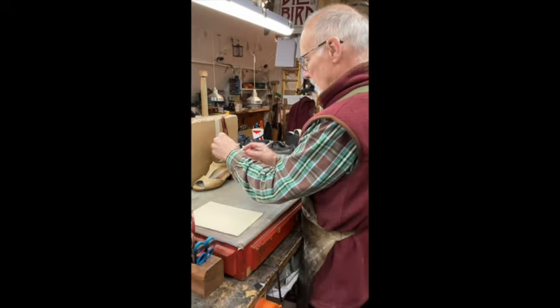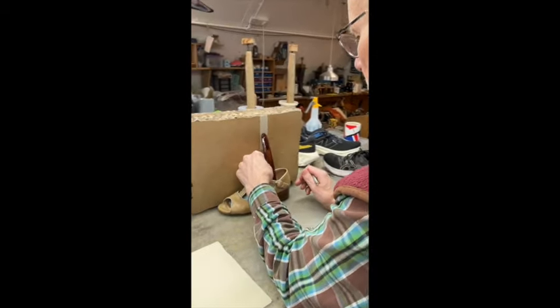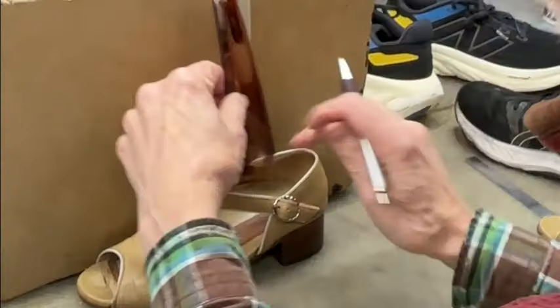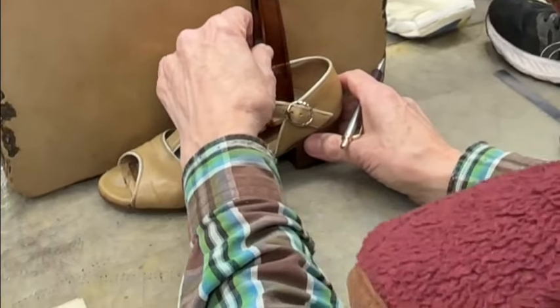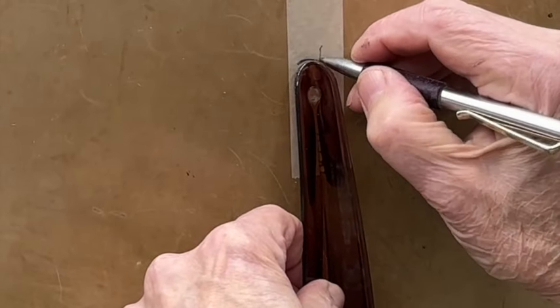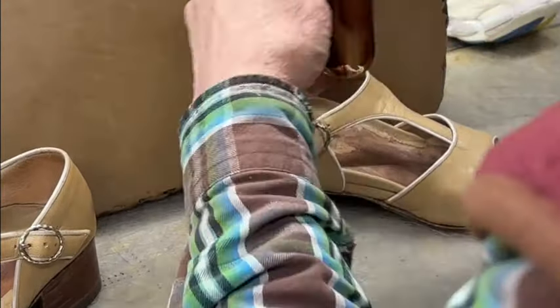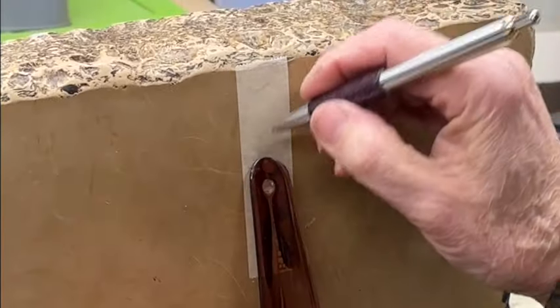Another one — this time a lady. We've got the inserts out, but just to see what the actual shoe is, so we can maybe design an insert that balances it once we know what it is. Right in the center of the leg — as long as you do the same thing each time — right in the center of the leg. Here's the higher one.